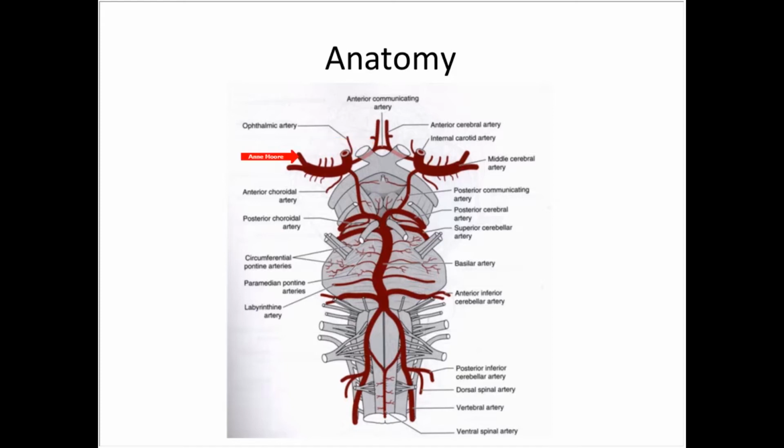Here we see the middle cerebral artery, M1 branch, divides and becomes M2 branches. Usually, transcranial Doppler can pick up only one of these branches, and then the other branch, if there's a stenosis or vasospasm, that pathology could be missed.